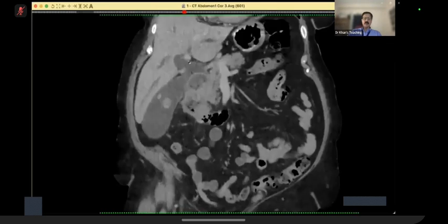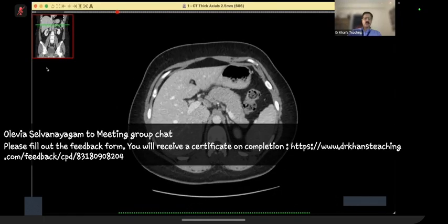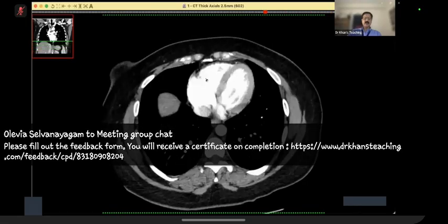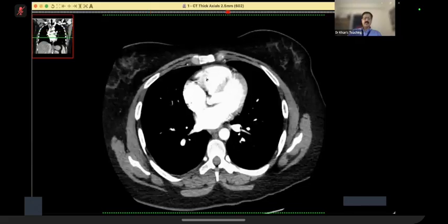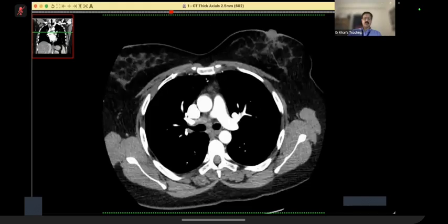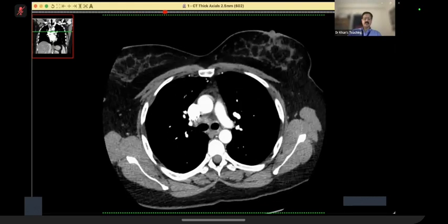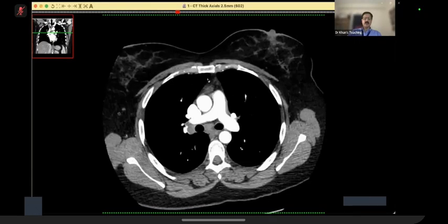So candidate 3, I liked your thought process, and that was well done. The only thing is that, I see what the mind knows. So this is what it is. Now you know that sarcoidosis can behave like this, and that is the biggest neuro mimicker in neuroradiology.